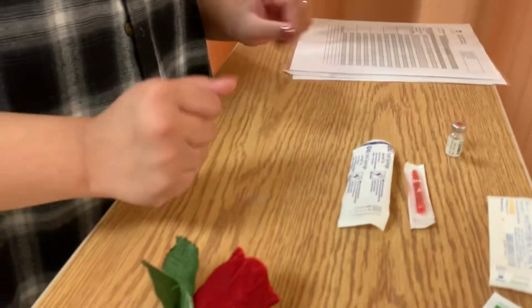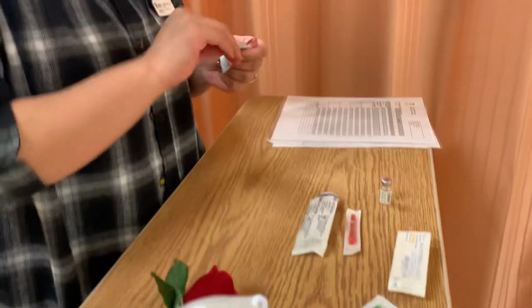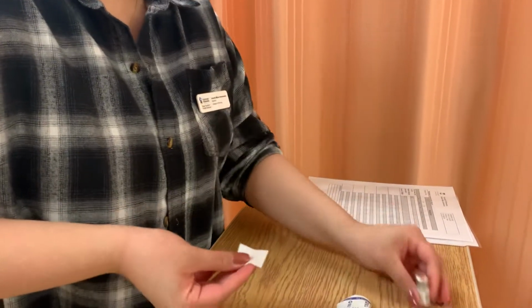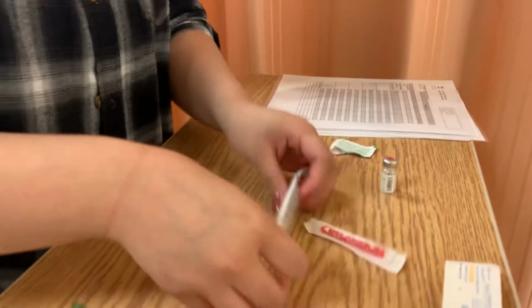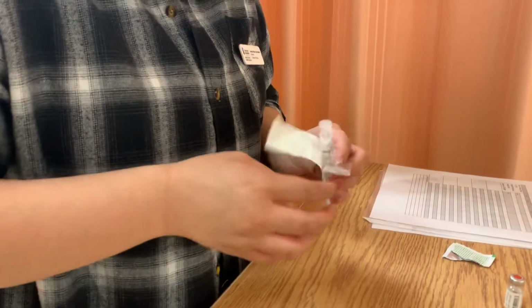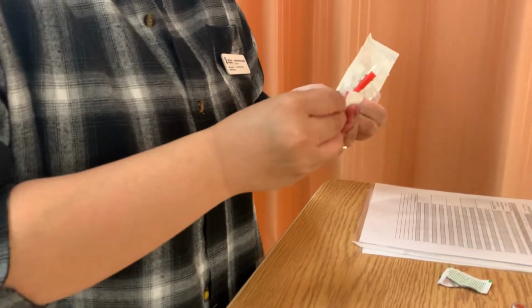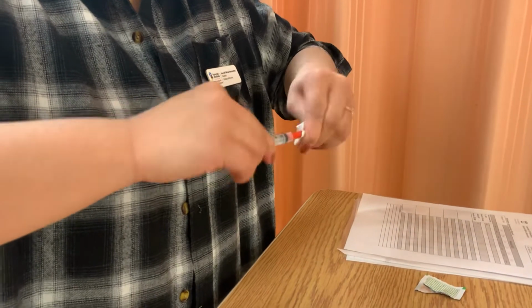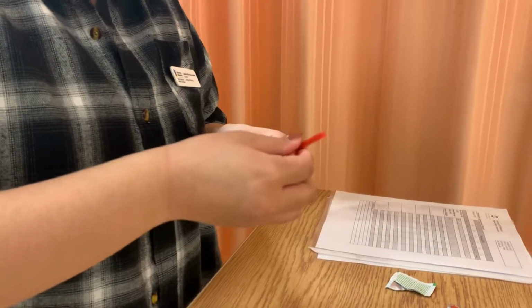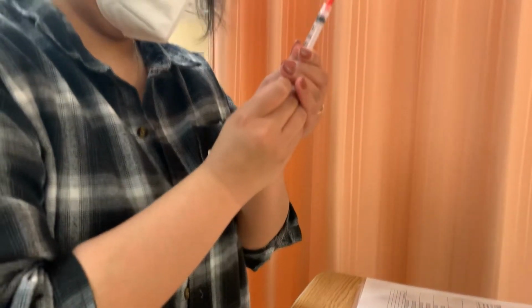Okay, now I'm going to prepare. I'm just going to double check. Okay. So I'm going to first clean my vial for 30 seconds and then let it dry. So while I let that dry, I'm going to get my syringe. Just going to do some twisting. Okay. So since I need 0.5 ml, I'm just going to make sure it's not sticky. So 0.5 ml.